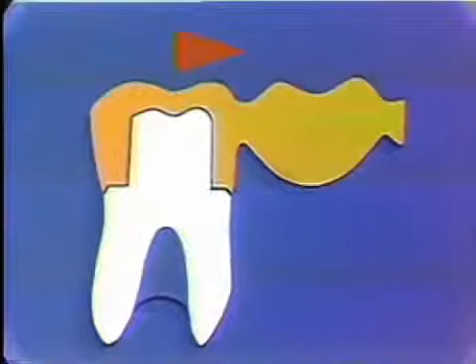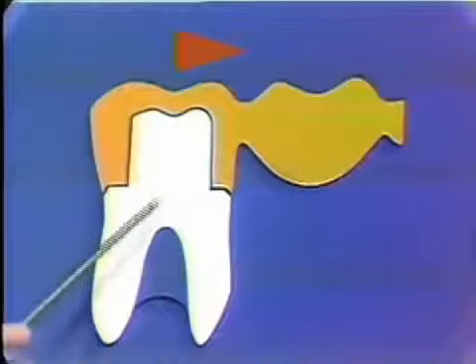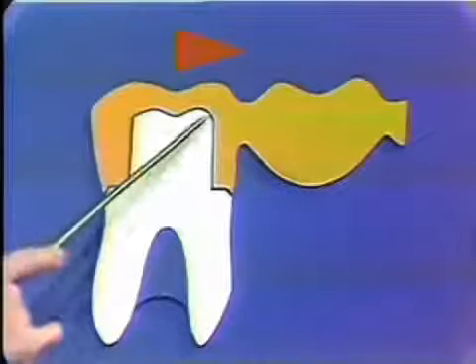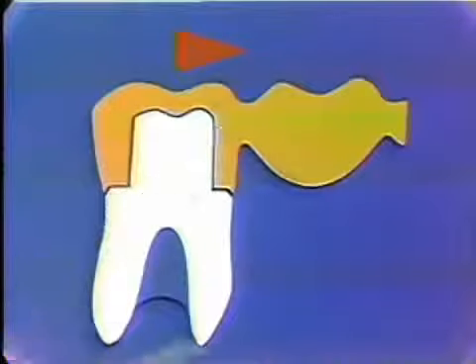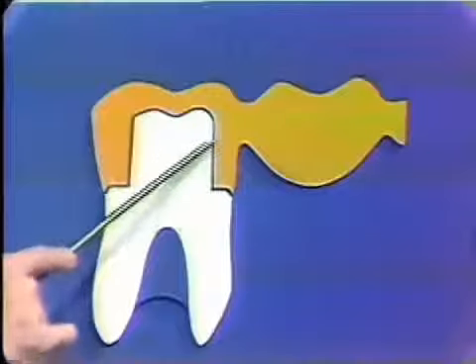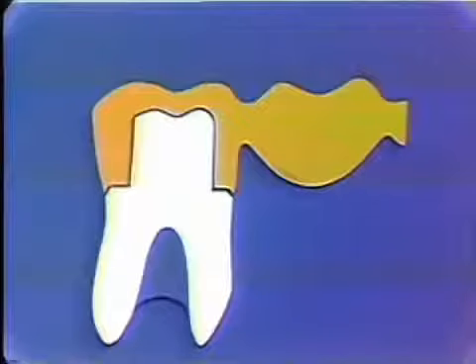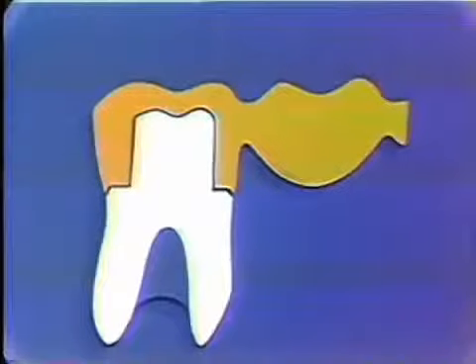As the teeth come into occlusion and the anterior component of force exerts itself, you'll see that in order for this tooth to rotate out of the retainer about this point, this part of the tooth preparation would have to move forward through the gold here, which it cannot do. You'll see also that the cement down here is now subjected to compressive forces and not to tension or shear forces, and it has a very high compressive strength, so it will withstand this type of force over long periods of time and not fragment.